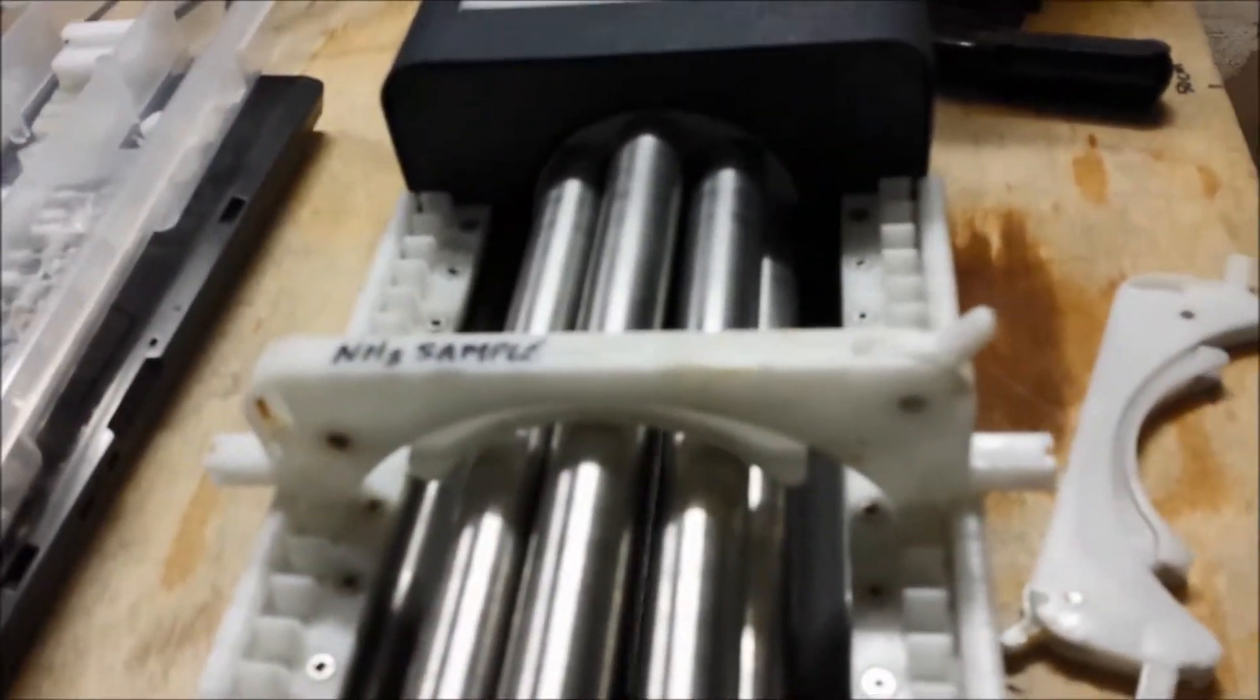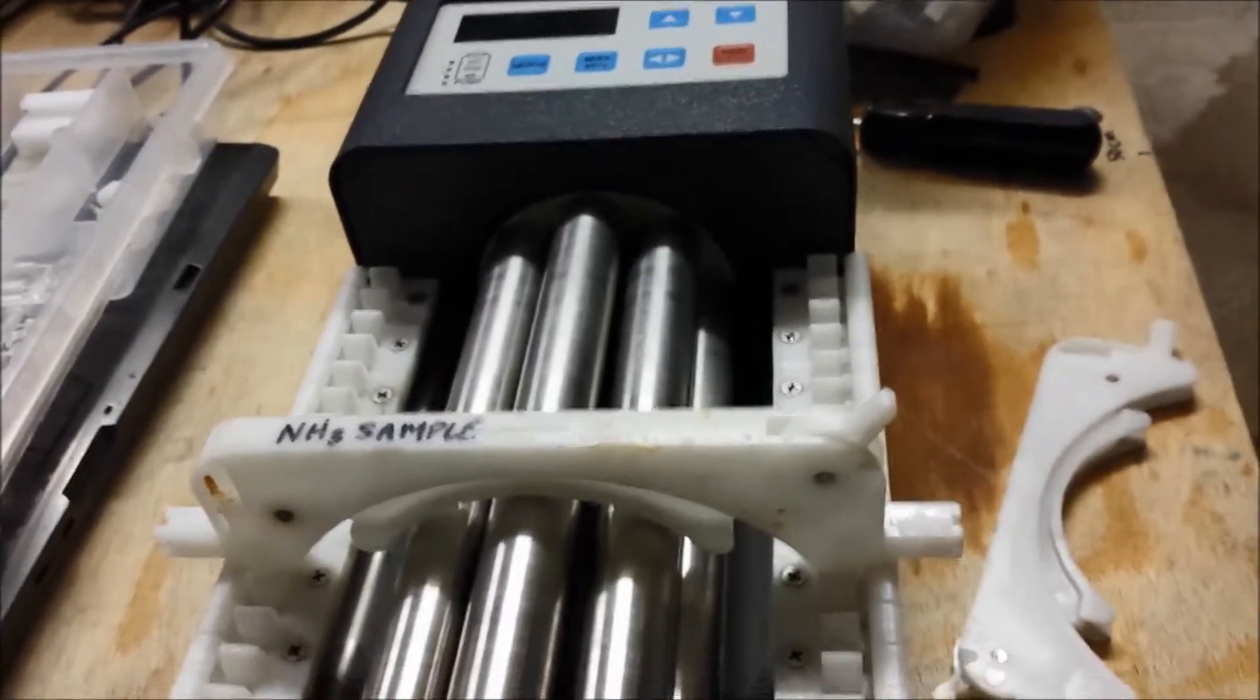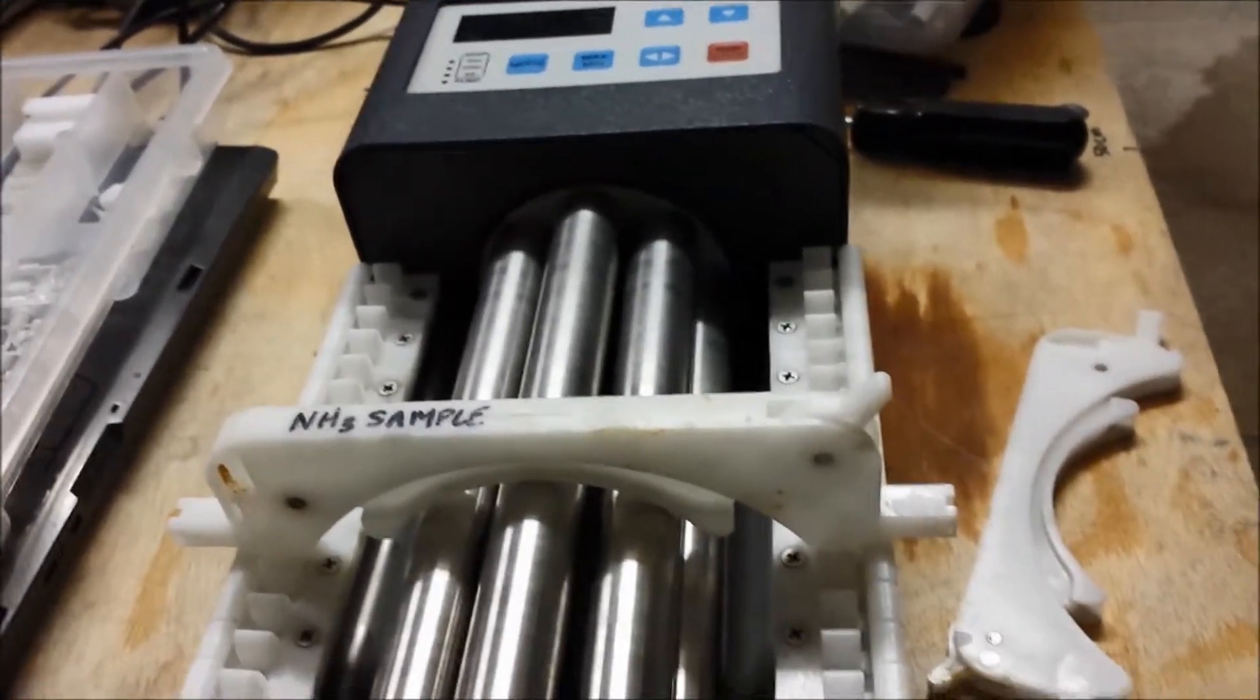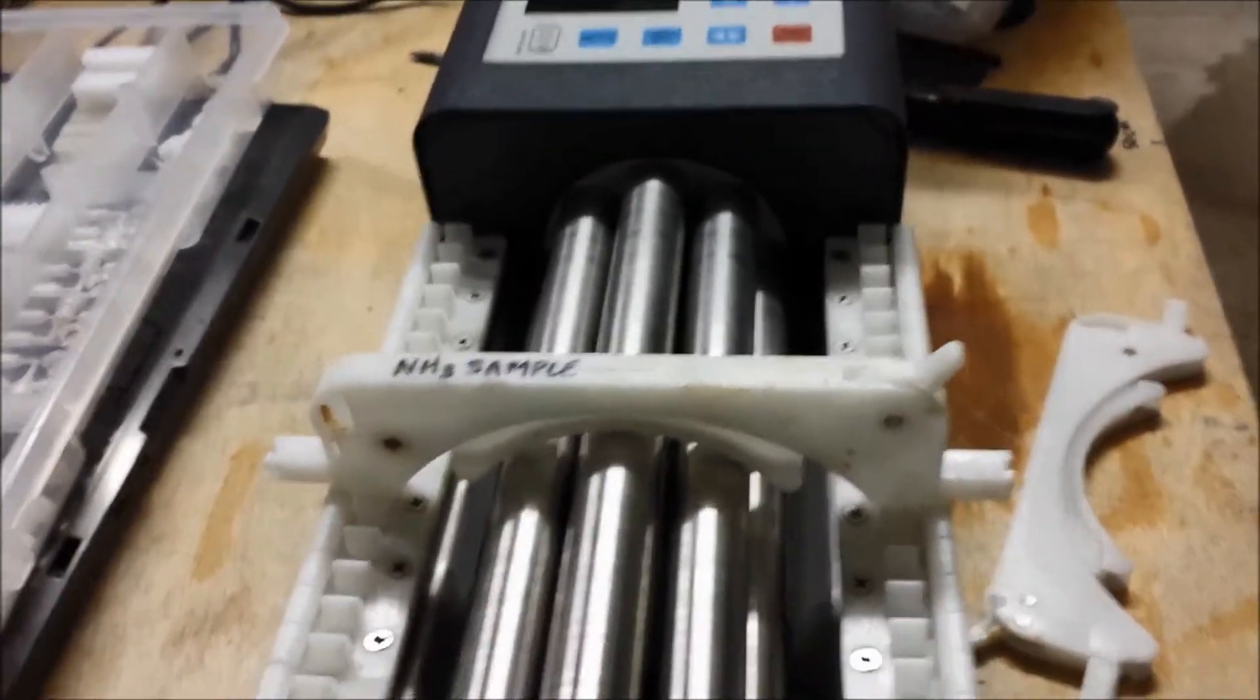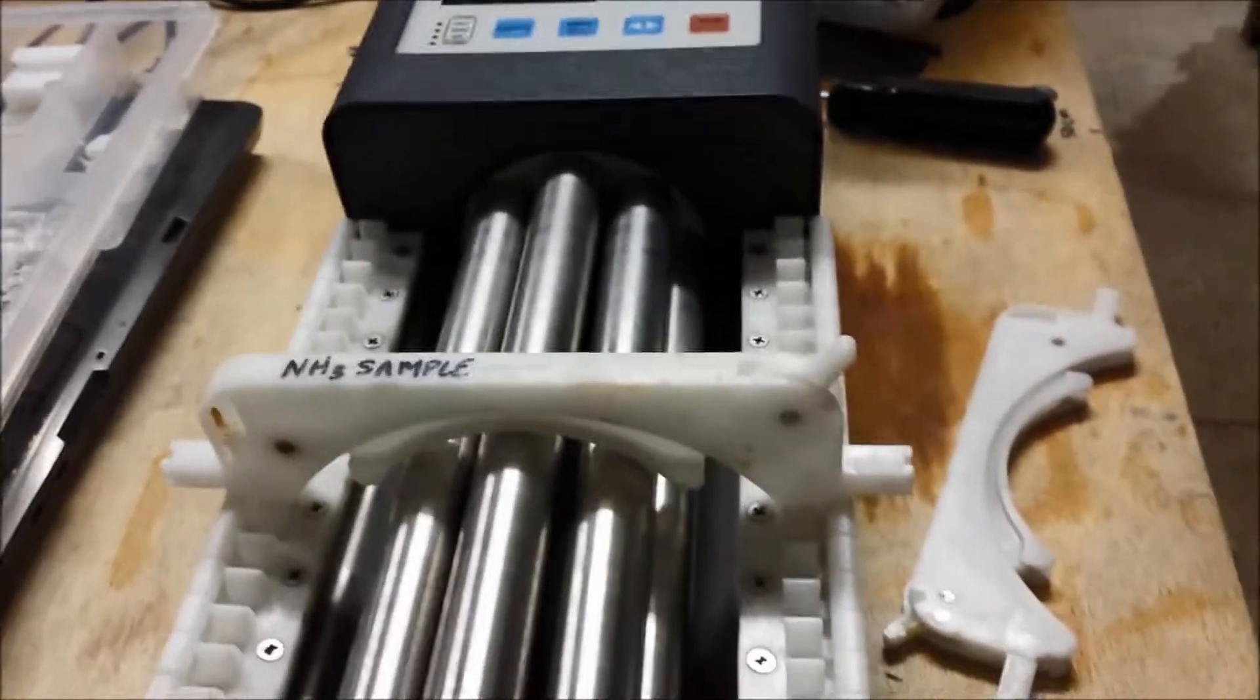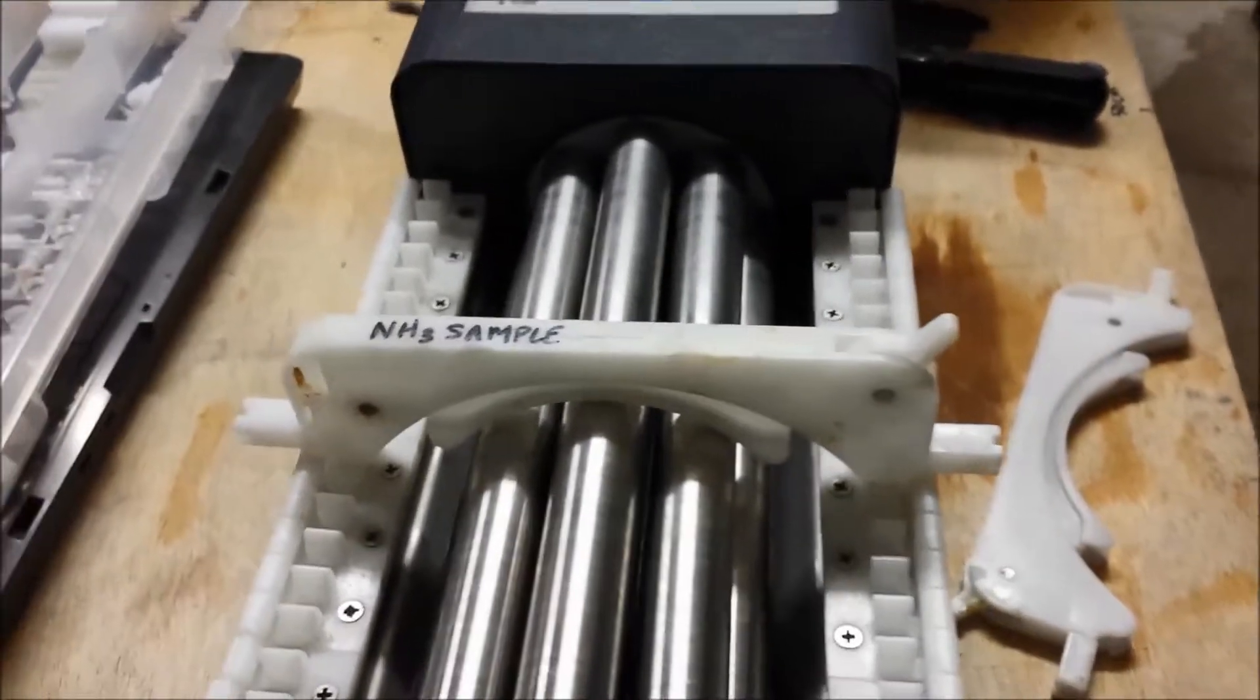Some pump tubes are smaller than others and might need a little more tension. Some are bigger and might need a little less, but in general, over tightening is a problem on these.